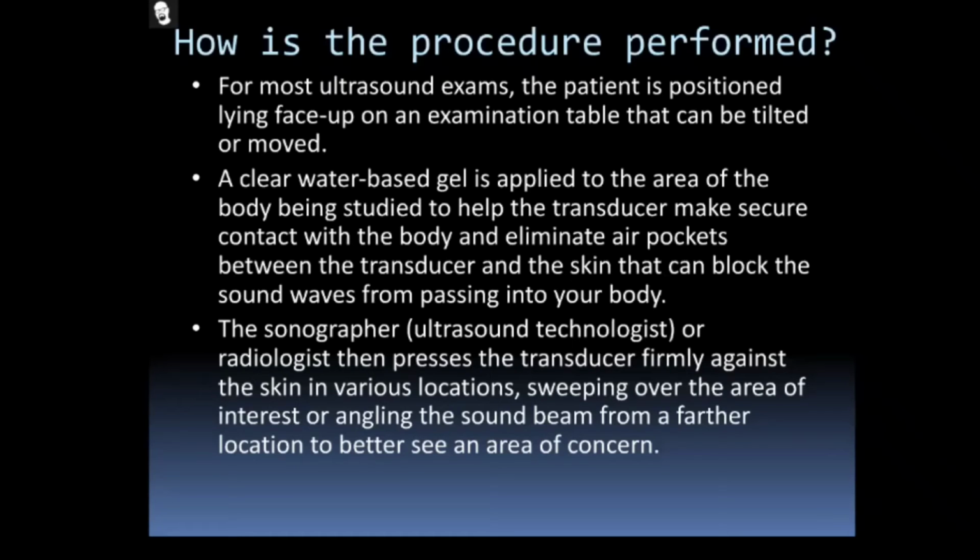The reason for applying the gel over the skin is that its jelly nature gives extra softness to the tip of the probe. With that smooth nature, it is easier for the sound waves to penetrate through the tissue into the internal organs. For example, if there is a rough surface, we can't move the probe smoothly. The probe would have ups and downs, and the travel of the sound waves would be affected. That is why the gel is applied over the skin where we want to examine.